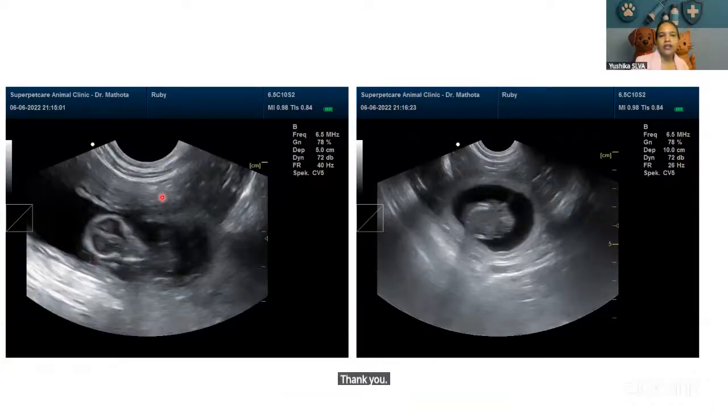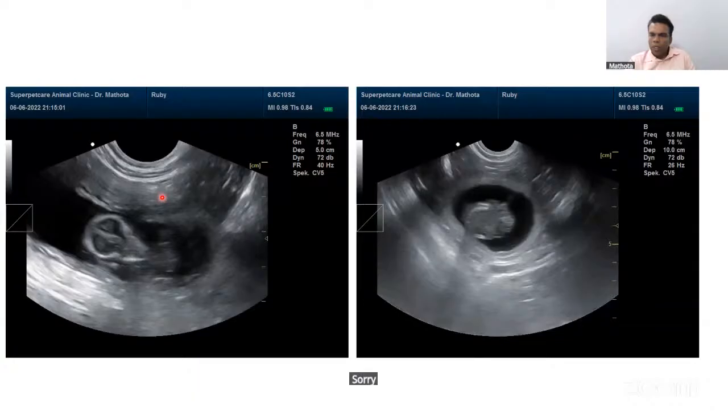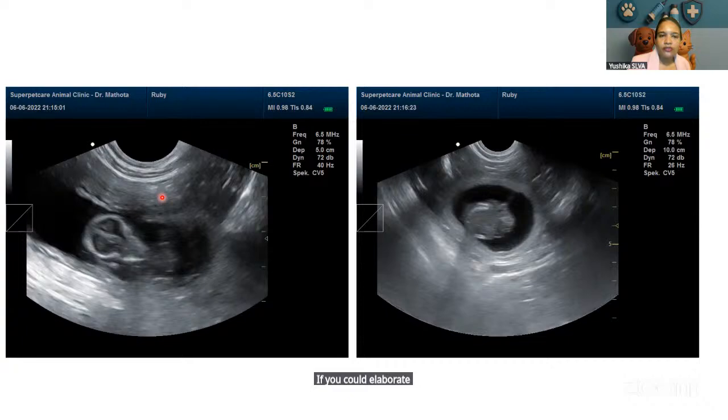Thank you, Doctor. And there is a question from the crowd. Dr. Ajit is asking whether you can elaborate on ultrasonography of chronic kidney disease cases.